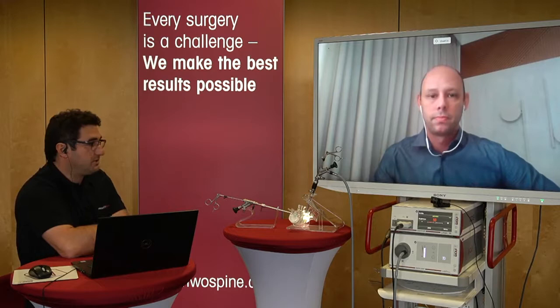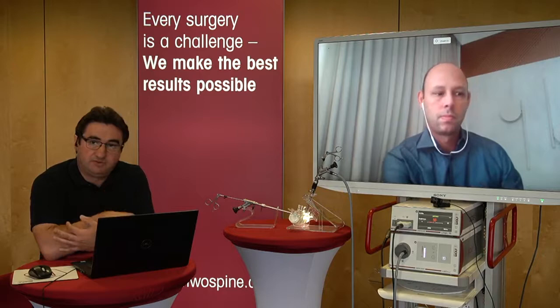Okay, maybe I can comment a little bit on my experience with the endoscopic stenosis optic. First of all, the diameter of the sleeve with the stenosis system is 1 centimeter. It's 2 millimeters more than the regular one. And as you mentioned, it's not possible, from my point of view, to do anterior decompression with a stenosis system.